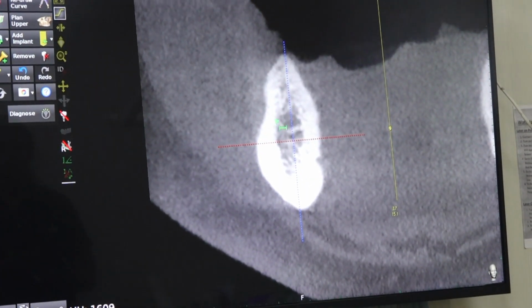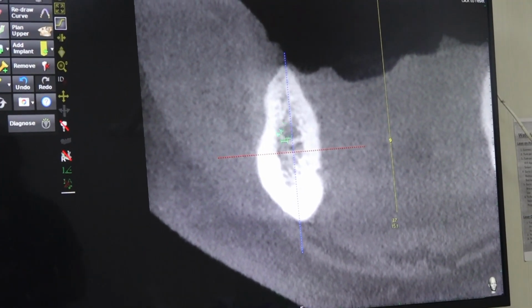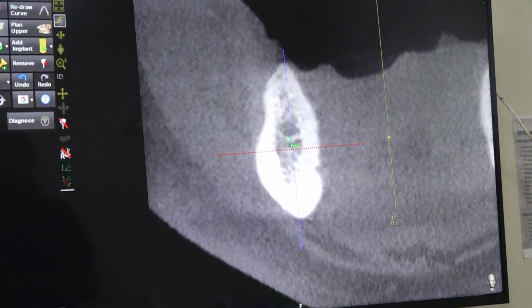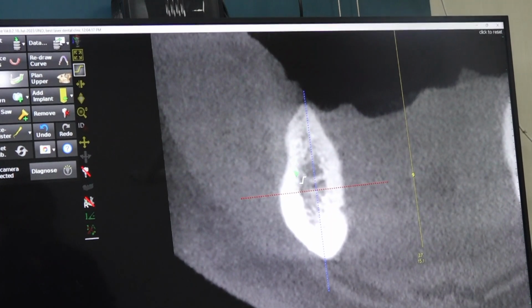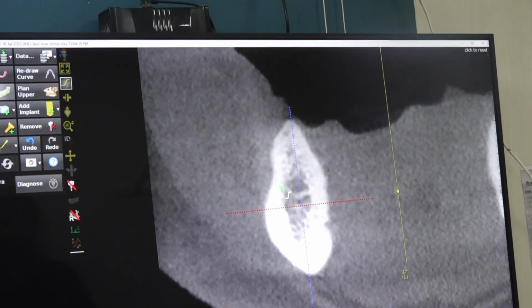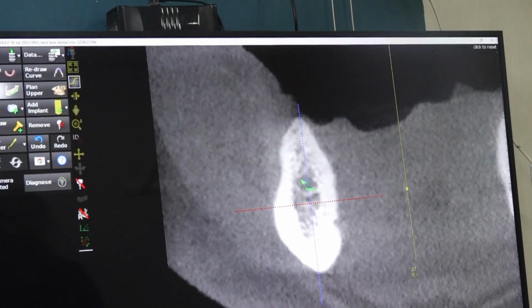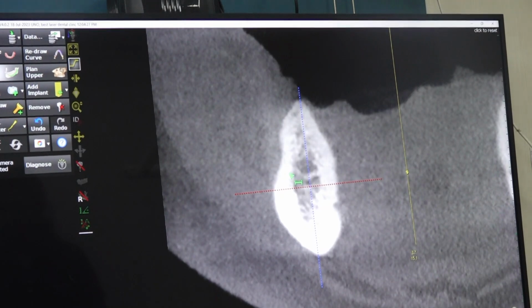This is very cortical bone. You have to cut this cortical bone, but at the same time you should not injure the mental nerve. If this bone is very thin, then it's an easy situation for doing nerve repositioning. It is better we should have a piezo if you are planning to do this.